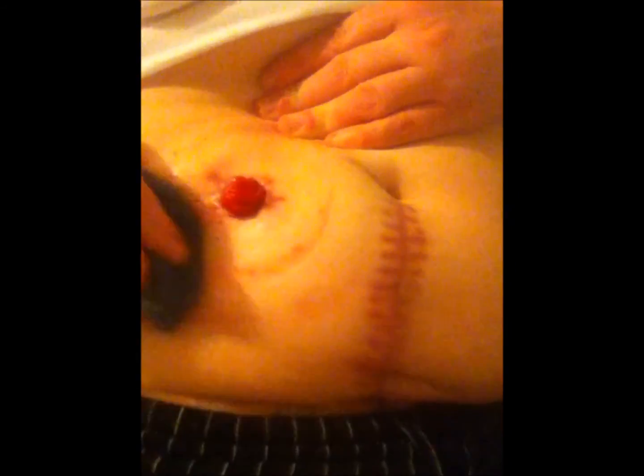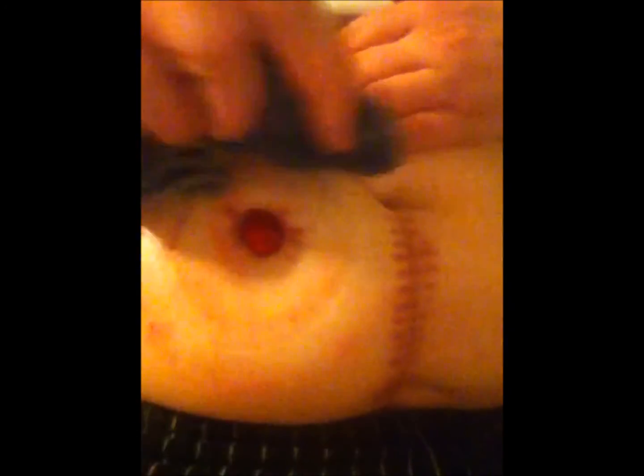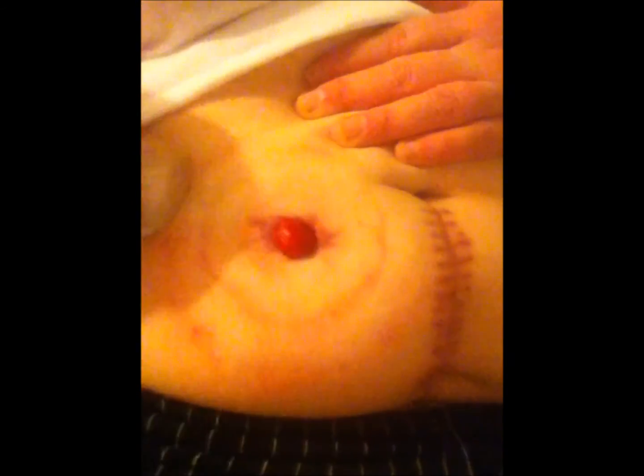And this here is my wet towel. It has no soap on it. And again, I'm going to just wash around there and get that nice and clean and try to take the soap off of it. And then once I use those rags, I can use a dry towel and really just dry it up. And it feels good to have it off for a little while because I have to live with this for the rest of my life.